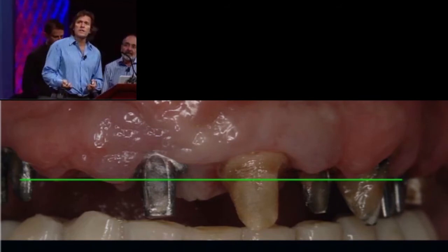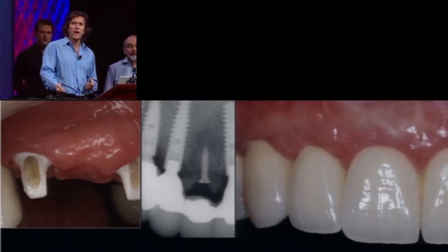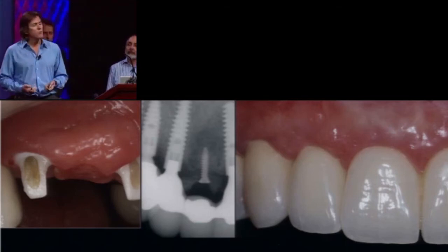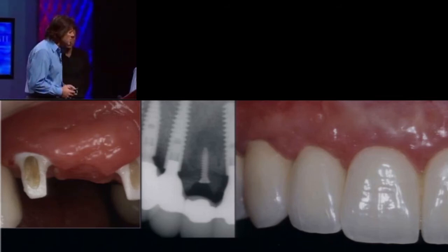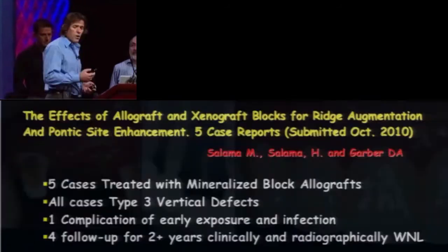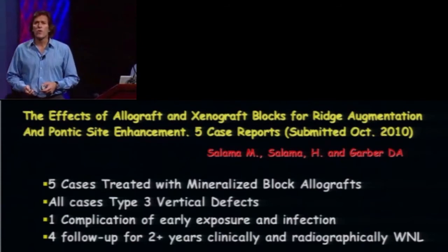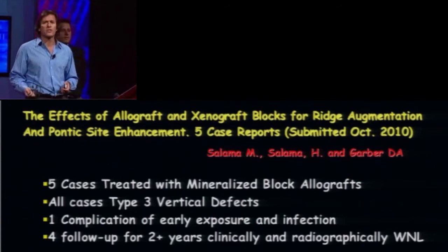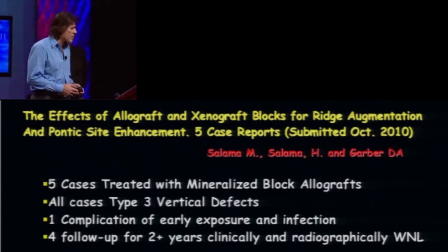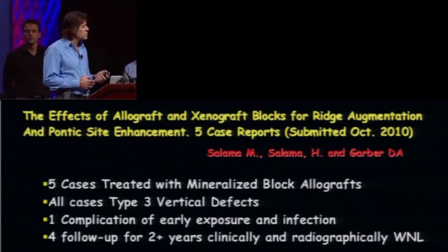And here you can see when we finalize the case, very, very nice aesthetics on the 2 platform-switched implants. And then, of course, that block now at 1 year after placement is not resorbing. Most importantly, it's supporting the dimensions of the pontic in 3 dimensions. We're publishing this. It's now been submitted for publication. We did 5 cases, a case report, all cases with type 3 vertical defects. There was 1 complication of early exposure and infection. The 4 others were followed up, and now 2 years post-op have maintained the soft tissue height, and the bone has also been shown to stay stable.